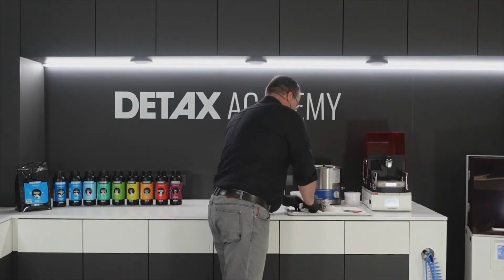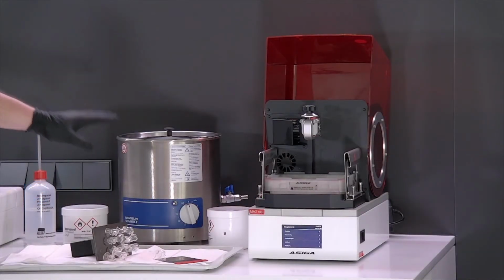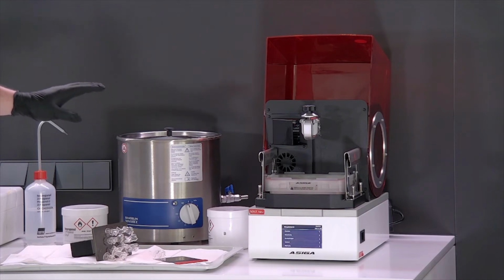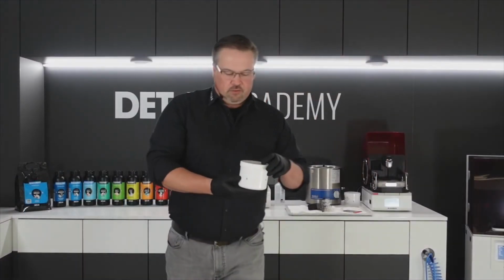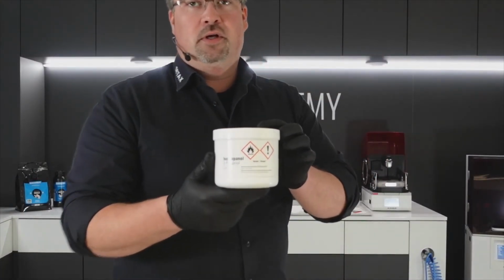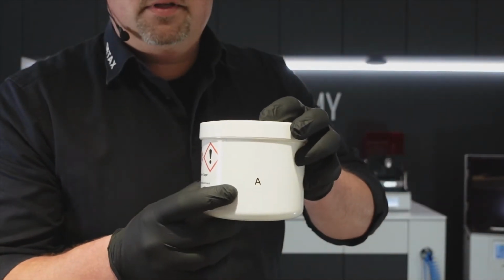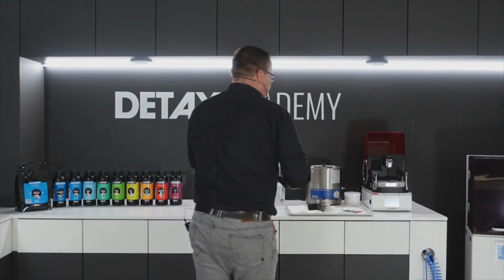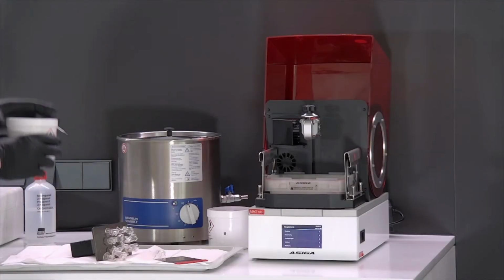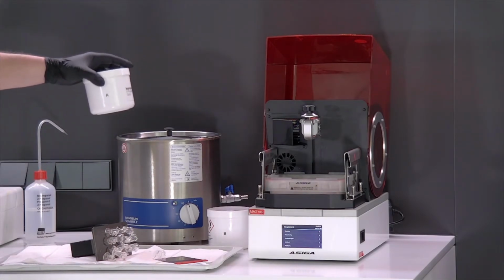To clean the material, we use an ultrasonic bath. Inside of the ultrasonic bath is water. Please don't take isopropanol alcohol directly inside. And our objects we will take into a box like this one. It is marked with number A. Number A means it is the first washing step. So we take the objects here inside, close it, take it to the ultrasonic bath for 3 minutes.